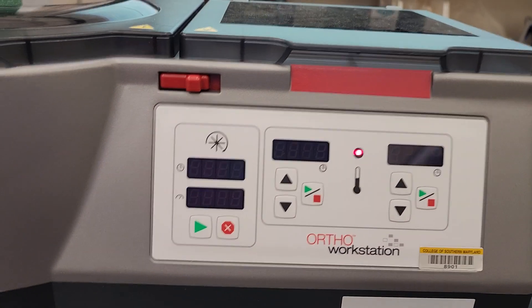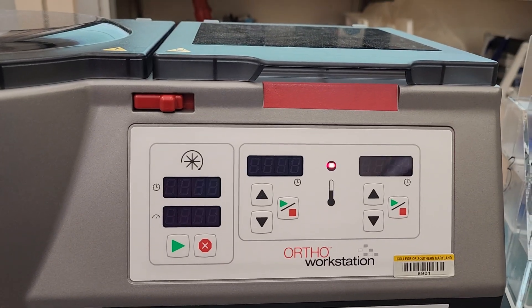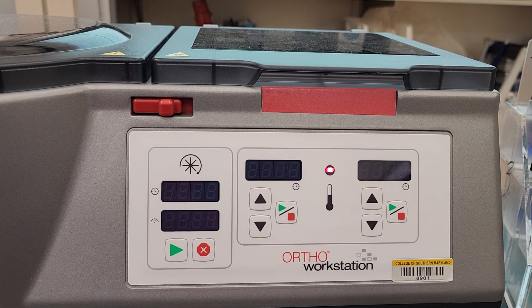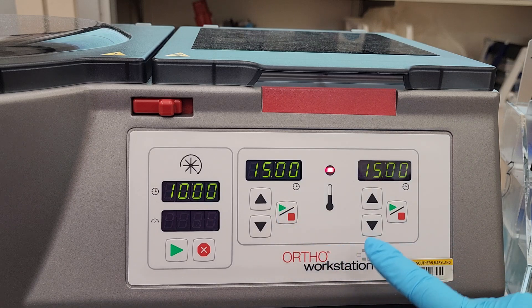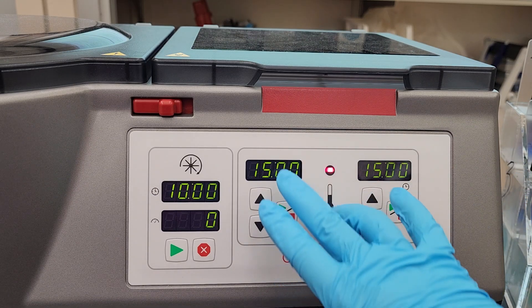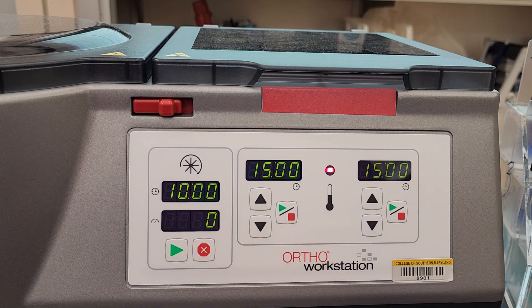And then it says it's going to start heating now. So as soon as the lights start blinking, you can press go and then it's going to start heating.